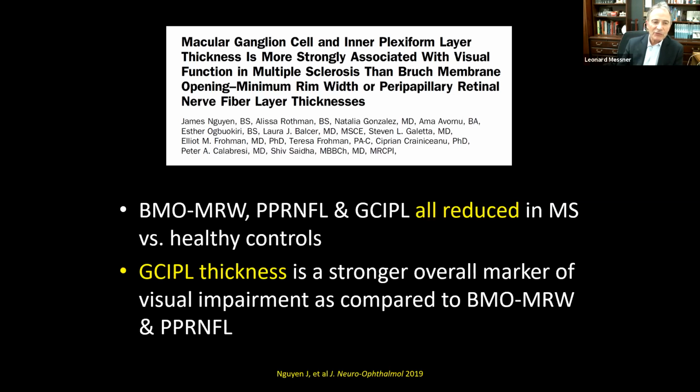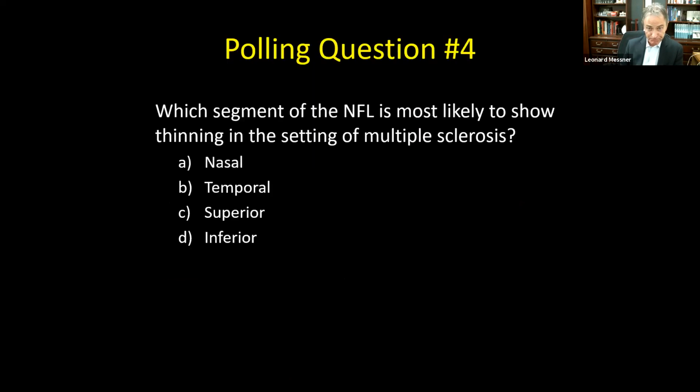And what was determined is that while both nerve fiber layer and ganglion cell thinning are both associated with some decrement in visual function, it's really the ganglion cell thinning that may be a more reliable indicator, more linked to visual dysfunction. And I think that that's something that we're seeing with other optic neuropathies. So more on that with future research.